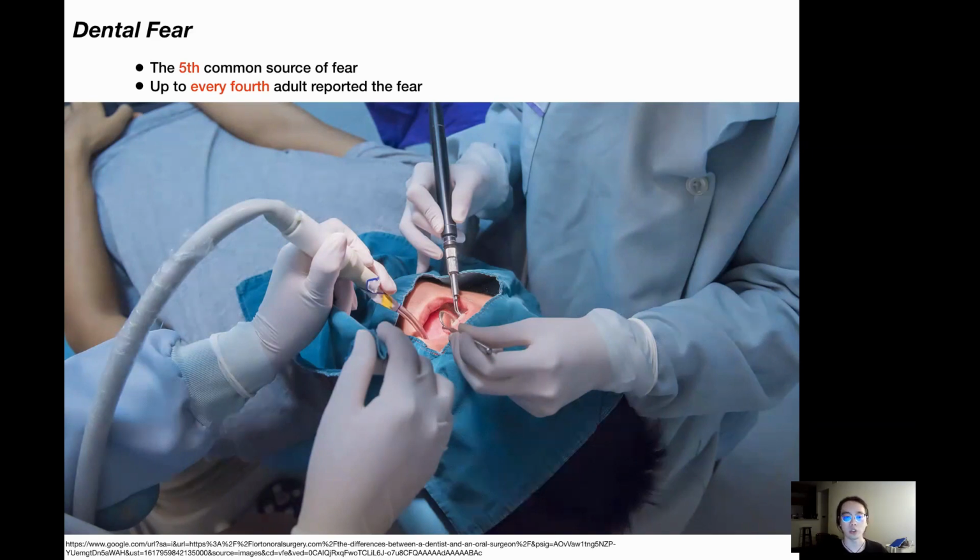One of the root reasons for dental fear is the fear of unknown things. Because of that, efficient patient education that unveils the treatment process is a key method to relieve such fear. In current practice, dentists mostly rely on verbal descriptions for education. However, it can be inefficient because dental surgeries can be very complex, and there is a high knowledge barrier between the dentist and the patient. So in this work, we propose a totally different way to do the education.